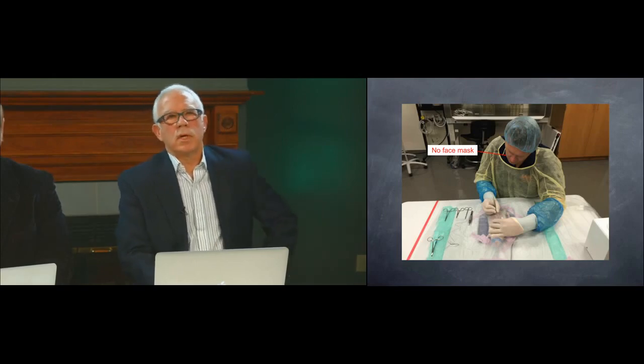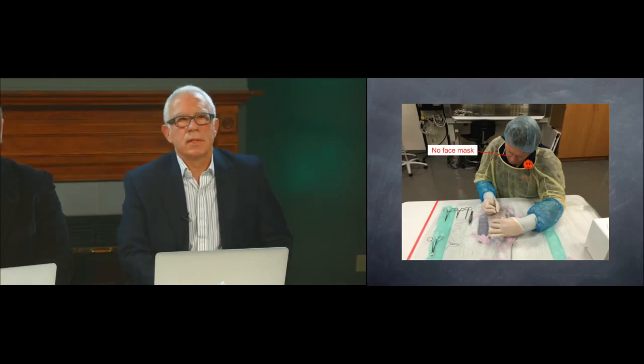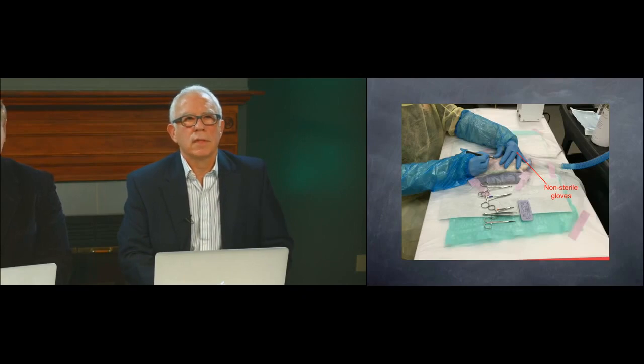So what's wrong here? You already can see it. He's using nitrile gloves, and we'll give him a double. Gloves should be sterile. You should use sterile surgical gloves unless you can confirm that you can sterilize them or that the non-surgical gloves you have used are sterile.